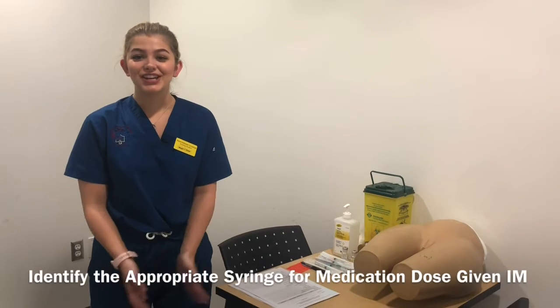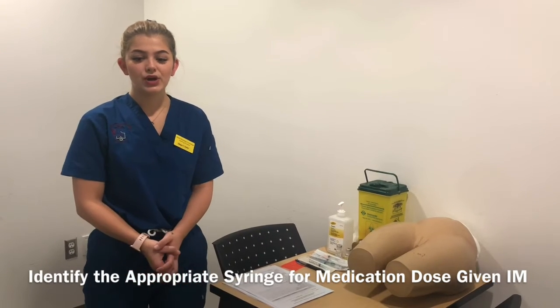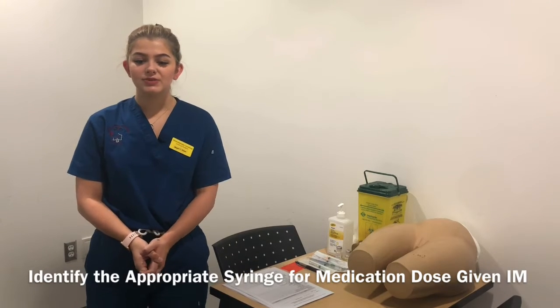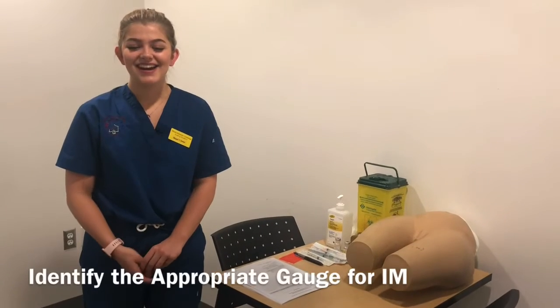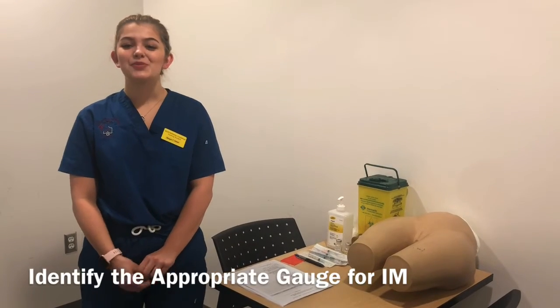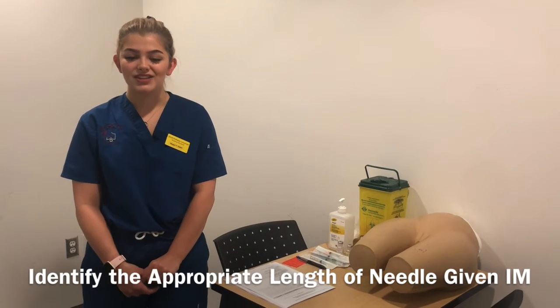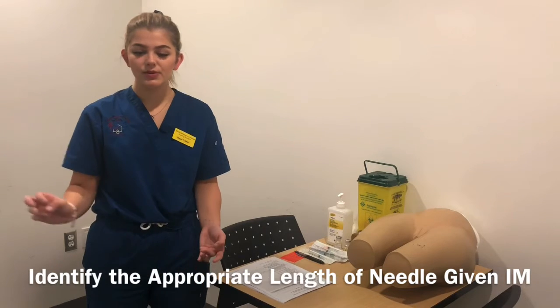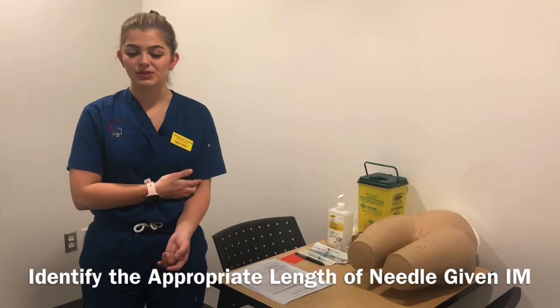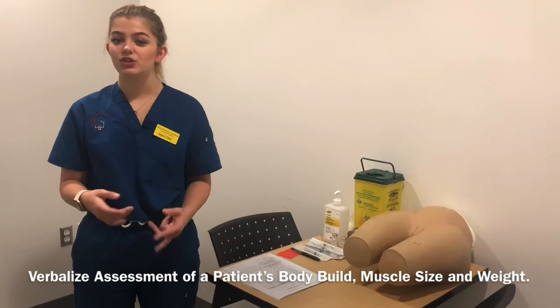For intramuscular injections, I'll be using a 2 to 3 milliliter syringe. So I chose a 1 milliliter vial because it's the most appropriate to give the 1 milligram of Haldol. The appropriate gauges are 20 to 25, and the appropriate length of the needle varies from 1 inch to 1.5 inches. So the needle is longer because you have to go through the skin, the adipose layer, and then get to the muscle. So if you have a bigger patient, you're going to need a bigger needle, and if you have a thicker medication, you would want a bigger gauge.